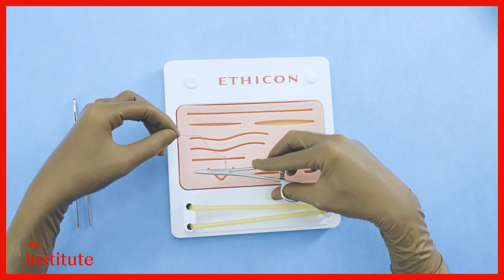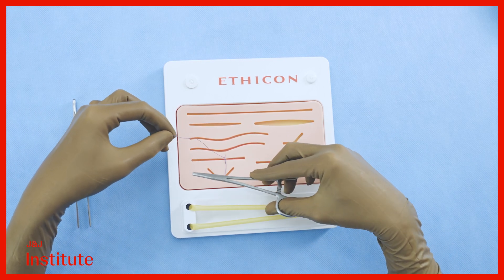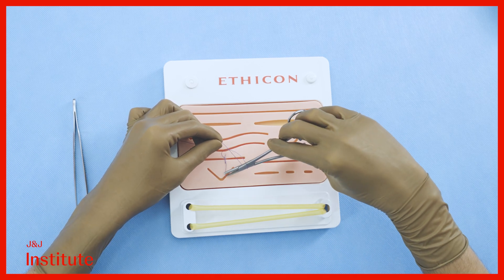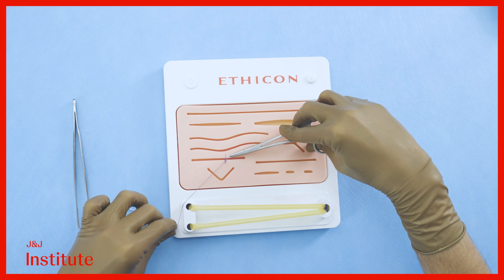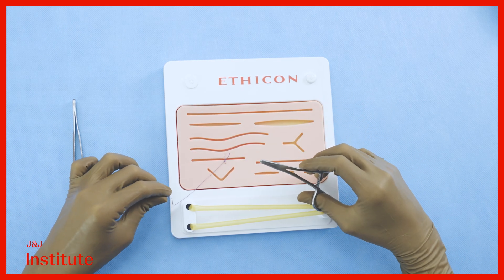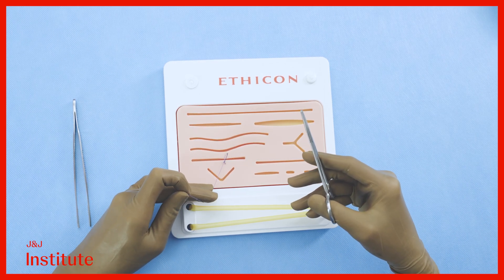To complete the surgeon's knot, reposition the needle driver parallel to the incision once again within the V created by the suture. Create a single loop around the needle driver, reach over, grab the tip of the short end, and cross your hands once again to create a secure surgeon's knot. Pull the knot to one side of the incision so as to not impair healing.